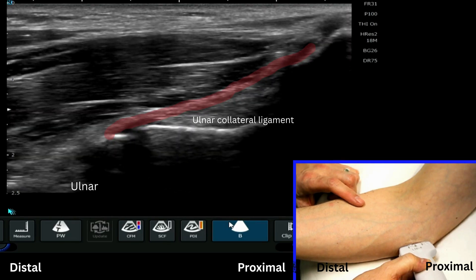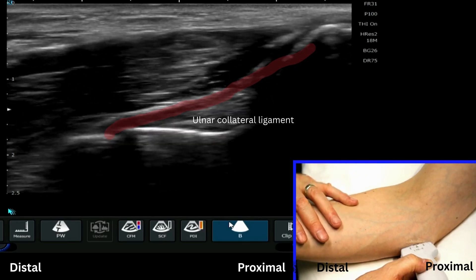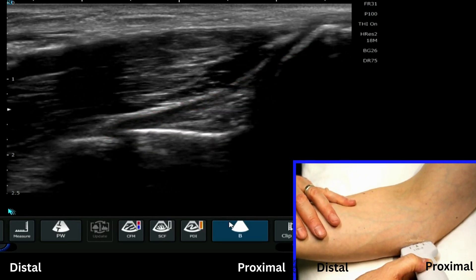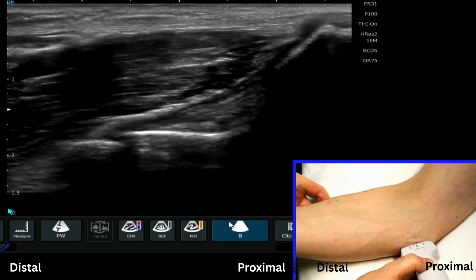A nice trick here is to just tilt the distal aspect of the probe down slightly, and this allows us to visualize the ulnar collateral ligament a little bit more clearly.